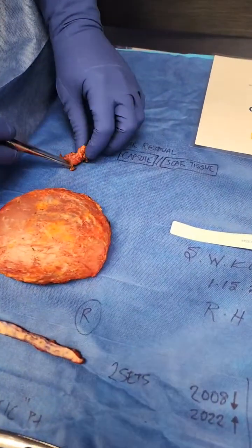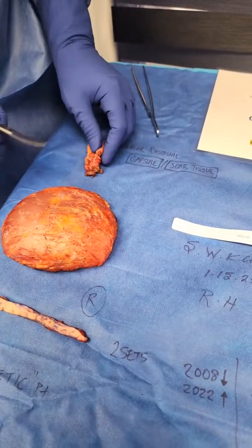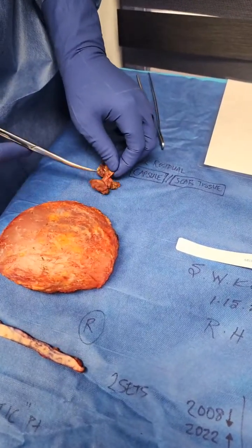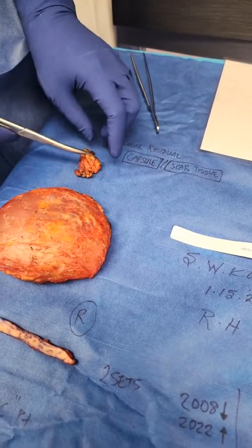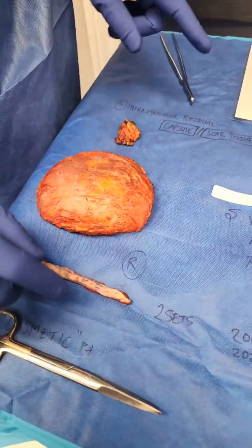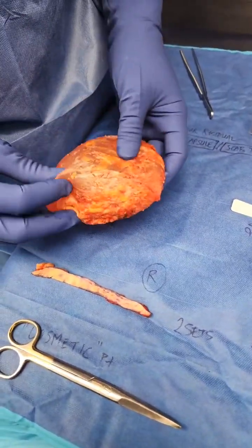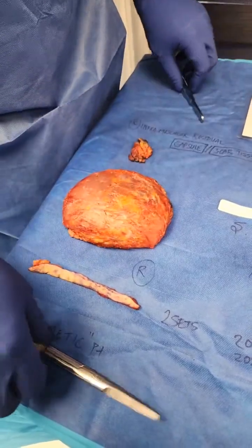This is the side I did first. And as you will see, if I cut this open, you will see that this is indeed a residual capsule. You can see the pocket on the inside, and this will be sent separately to pathology. You can see how much it shrivels and shrinks. The right side, this is the implant capsule. You can see how it's sitting. All inflamed tissue removed, and you can see some areas so thin, some areas relatively thick. I removed all of that inflamed tissue.